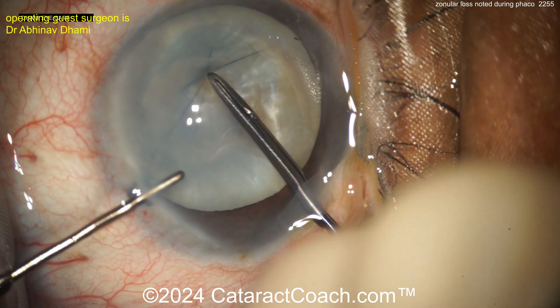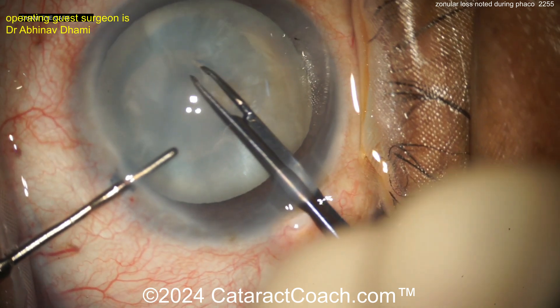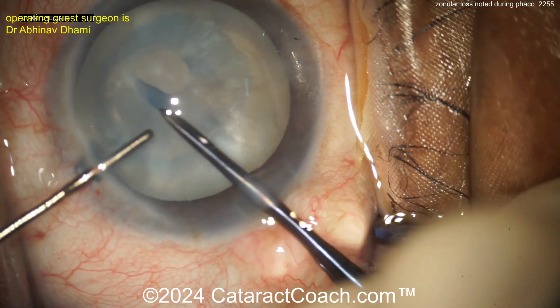Now here's the moment of truth. Start the rhexis. Look how wrinkly and loose the capsular bag is. So the anterior lens capsule wrinkles like that — now you know you're going to have some challenges.